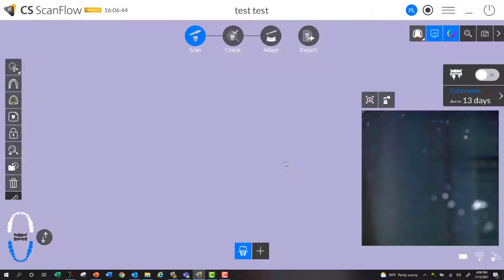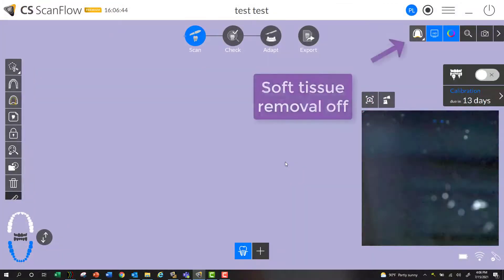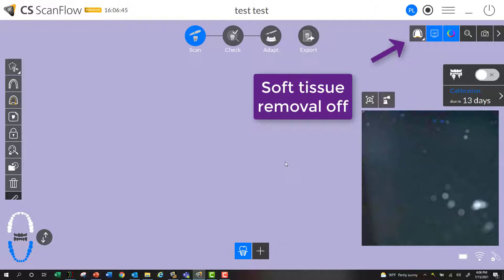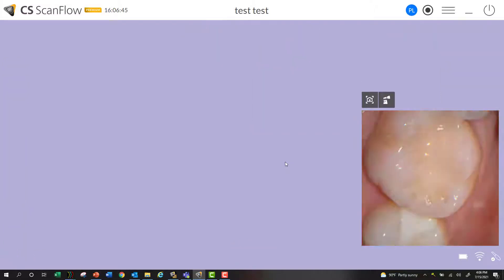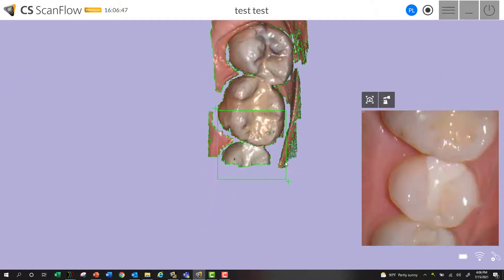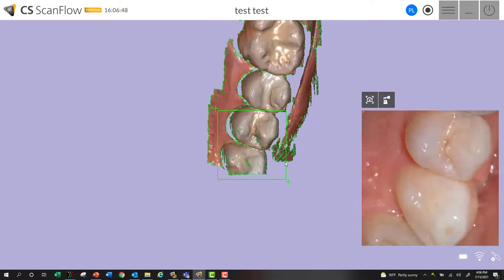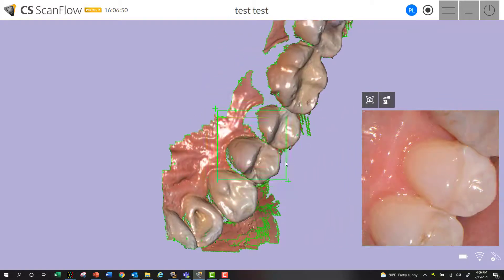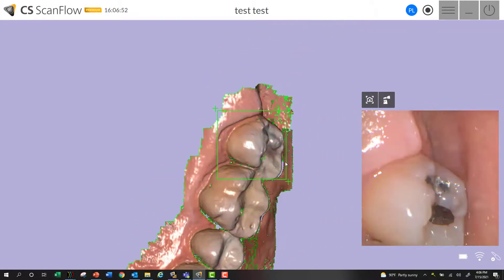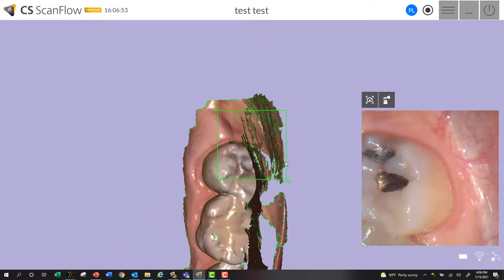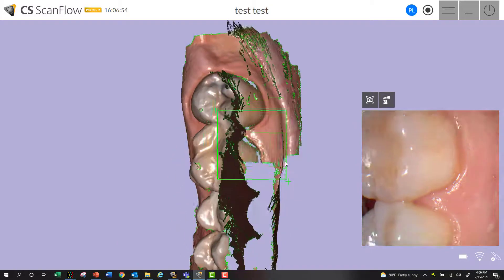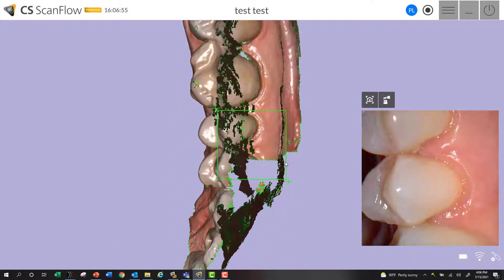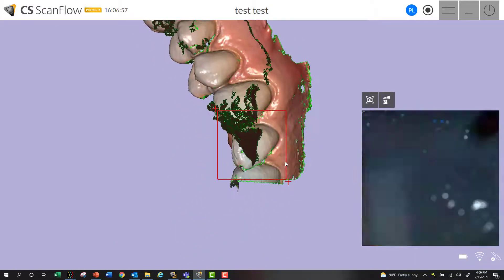Here's a couple of examples. In this first example, the soft tissue removal is off and I'm scanning with the 3800, purposely catching a little bit more of my cheek. When I roll around on the buccal, you can actually see it does get rid of soft tissue still, even with it off, just not entirely.